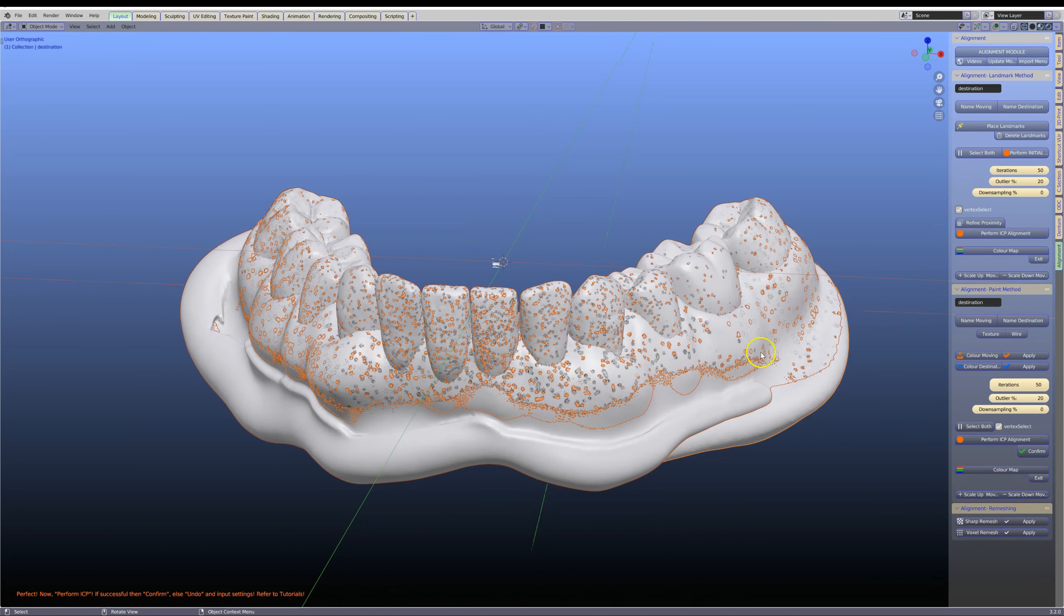This is quite easily done because one of these dentures is the new denture, which is the reline, and I'm going to name that. The other denture is the existing denture, which we're also going to name. Now these are two different colors, and we can see how these have changed somewhat.